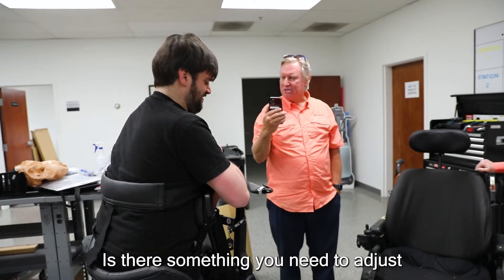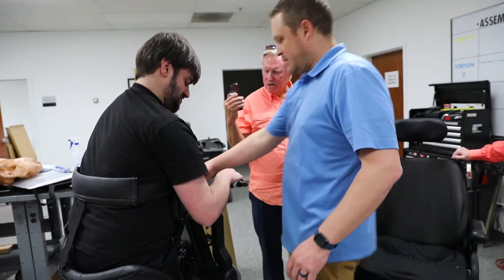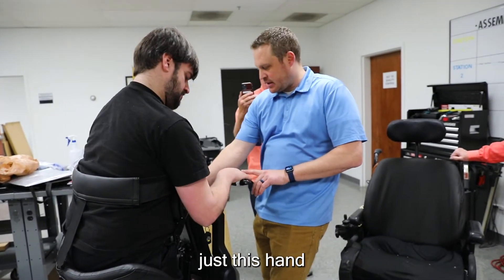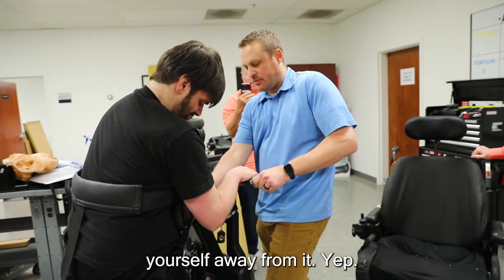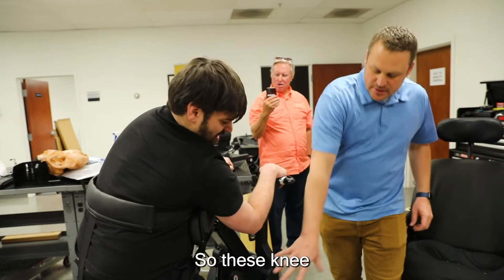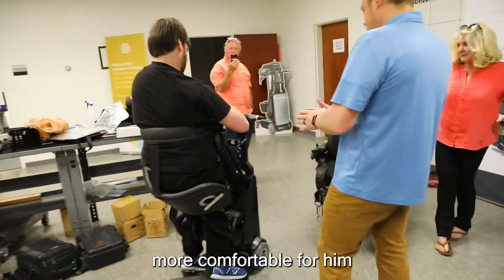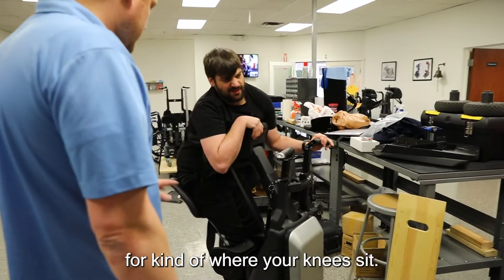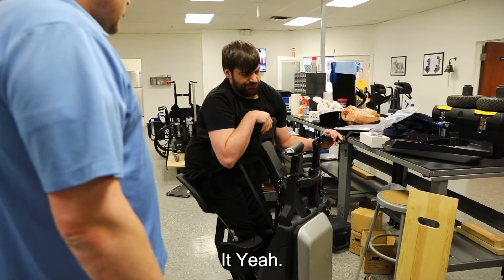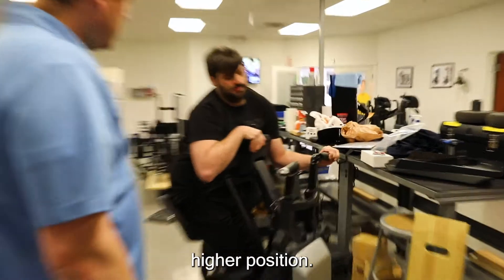How's that joystick — is that part with it so close to your chest not what you're used to? Is there something you need to adjust? Do you want to sit back a little further? Just this side, just this end to sit back, then push yourself away from it — just like that — to wherever it's comfortable, then let off and it'll stop you there. These knee supports are really adjustable as far as how far out, all the angles and everything, so you can make that more comfortable. It's a demo model so it's just kind of ballpark in the middle rather than being specifically set for you.